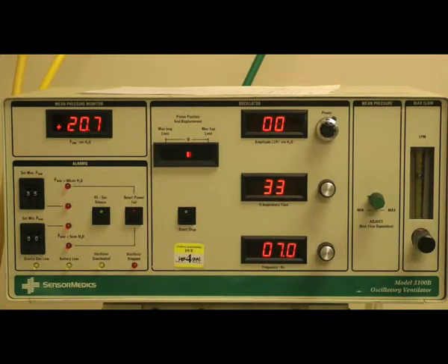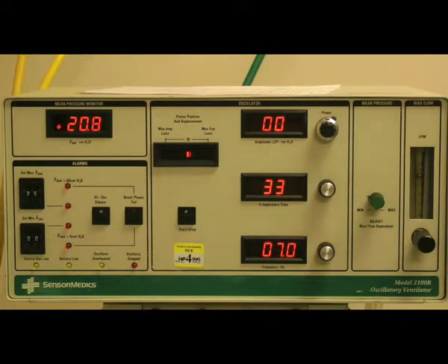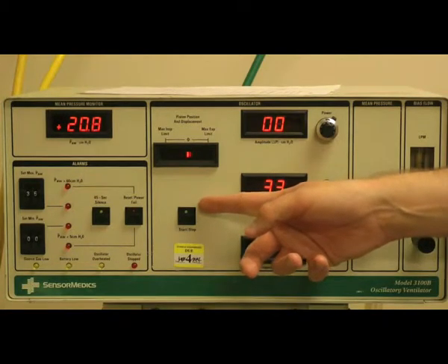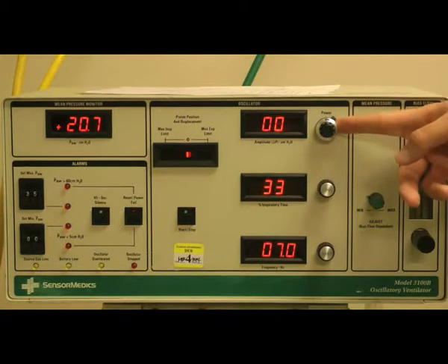After 45 seconds, you need to reduce your mean airway pressure back to your initial setting of 34 and reset your high mean airway pressure alarm to 40 centimeters of water pressure. You will then turn the piston back on, reset your delta P to 90 centimeters of water pressure, and observe the patient for 10 minutes.